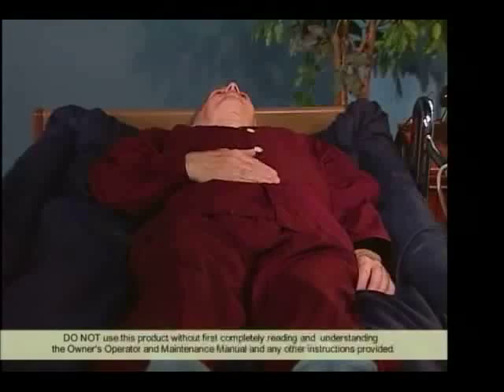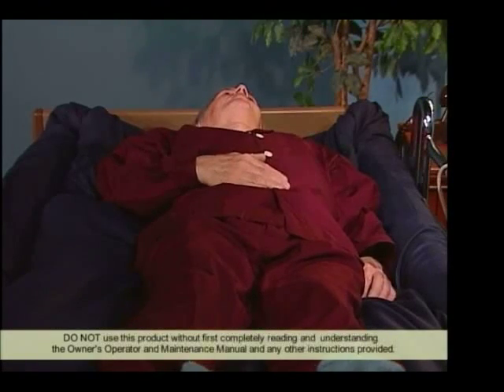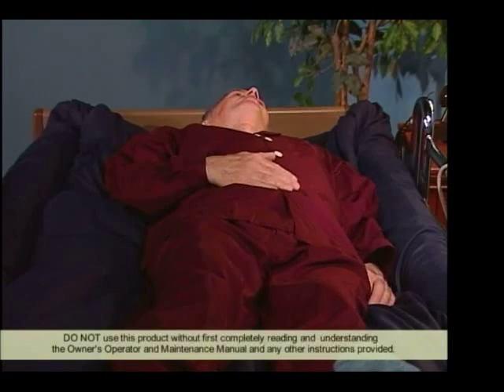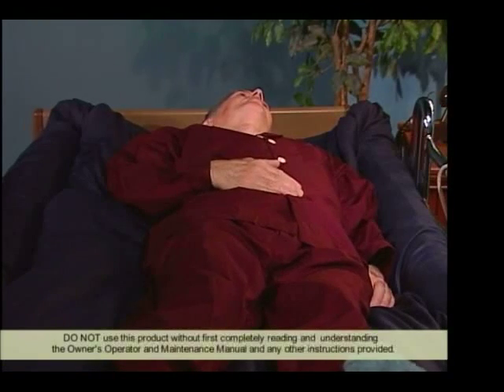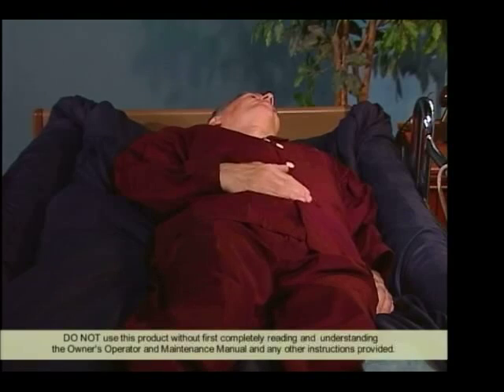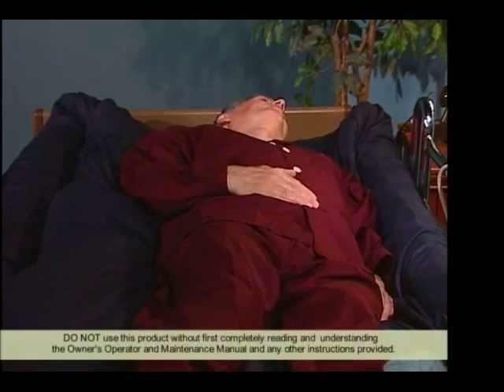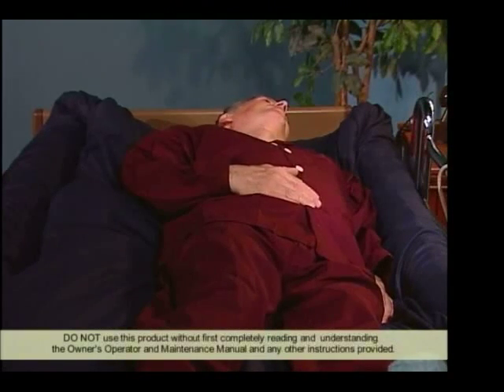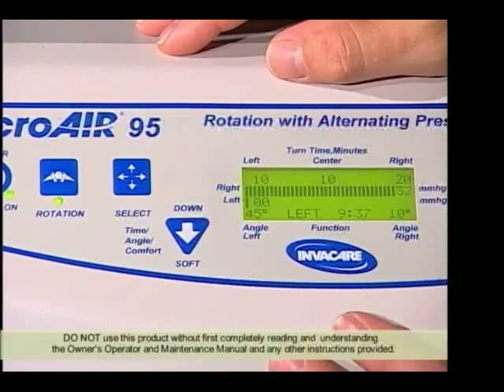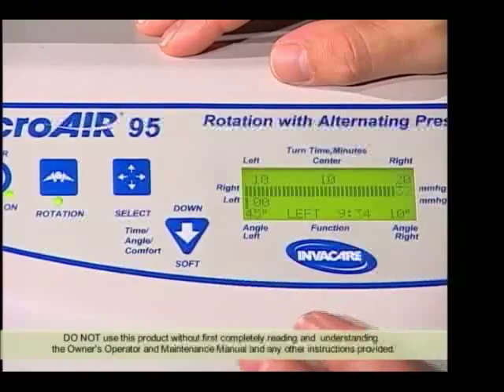You'll see that it's going to inflate the right side and deflate the left, so it turns the patient to the left. The speed of rotation is controlled by the power unit itself, so the amount of air that it's putting out will turn the patient. It has a timer on there so you know how much longer the patient is going to be on that side before the cycle is finished.